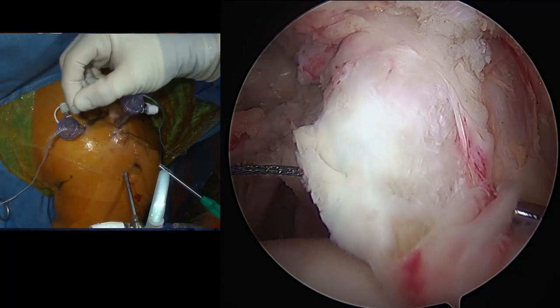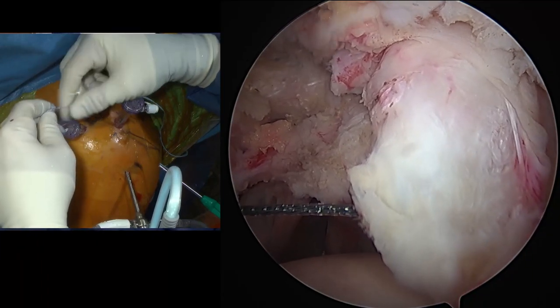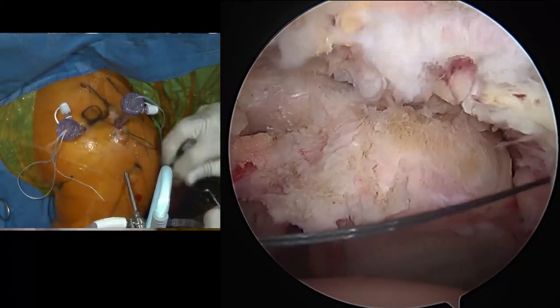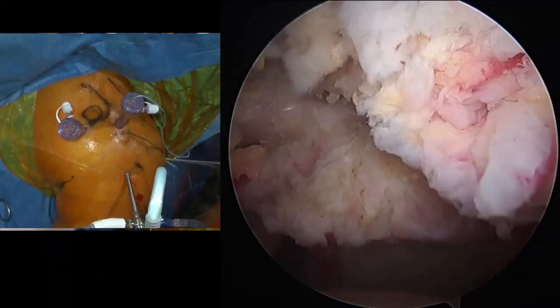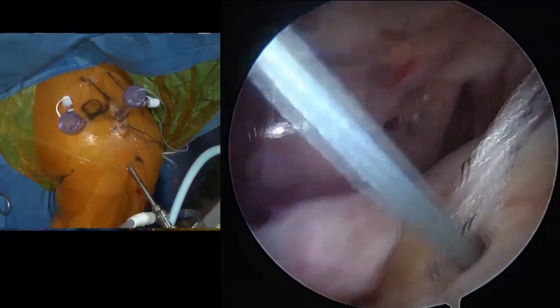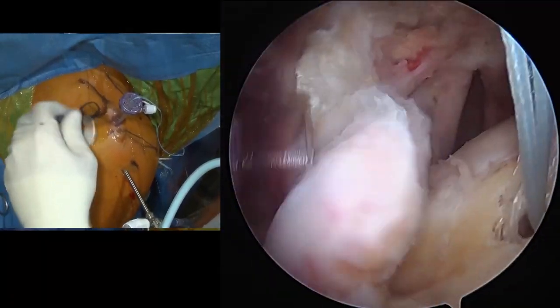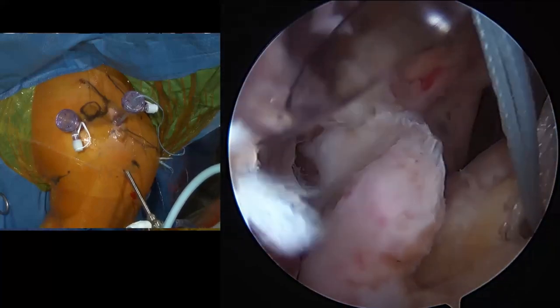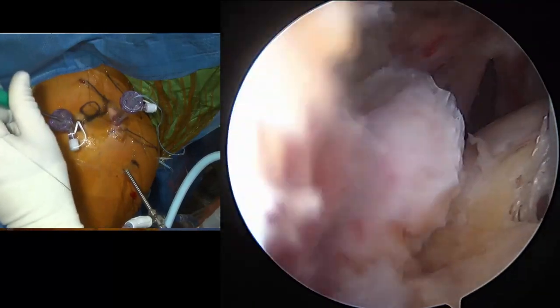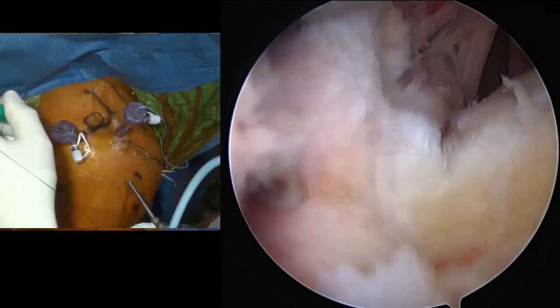So once we pull the wire through the proper part of the tissue, then we can pull our tape back through that area. And this will be our medial row for our double row repair. Okay, now a couple things. One is that there's a fair amount of tension here, so some of that has to do with the way this has been torn. So we're going to try to reduce that by giving us a help stitch here. So let's have our lasso again and find a number two fiber wire. Gotta make sure I'm not gathering the biceps. The biceps should be below us here.